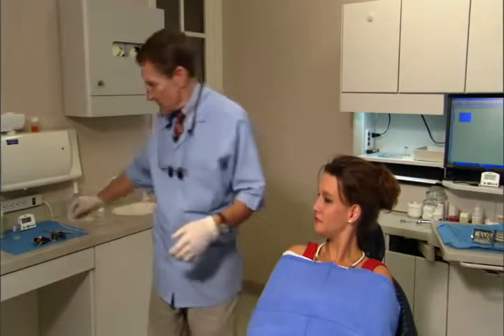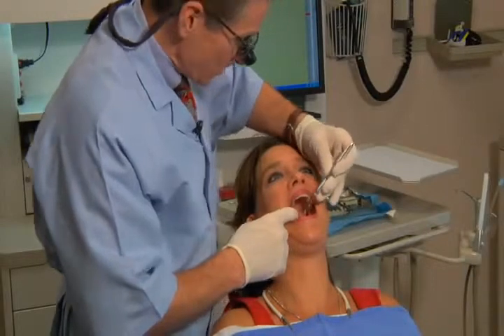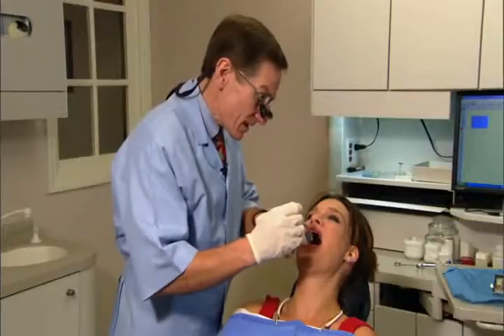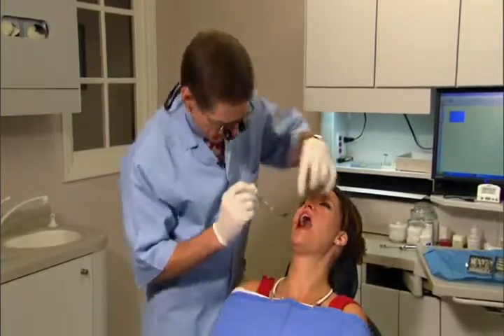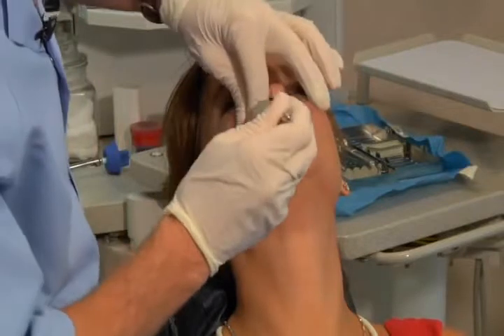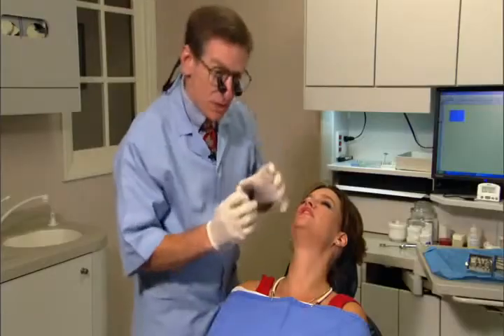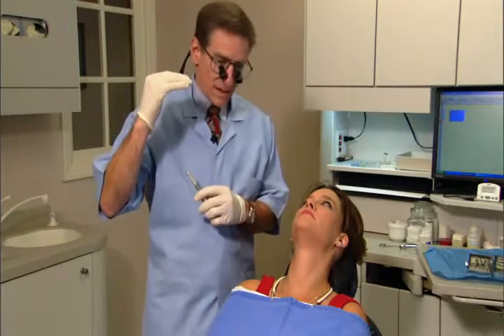Step one: do a really good oral exam. Take a look in the patient's mouth — get a light, a mirror, and some loops. Look under their tongue to see if there are any tori, which can run into the tray. Feel the depth of the floor of the mouth with your finger. Look up into the palate for tori there, and loosen up the cheeks to look into the vestibule.